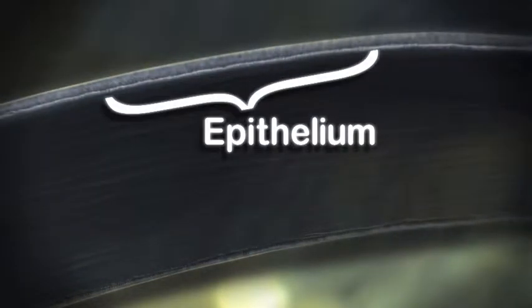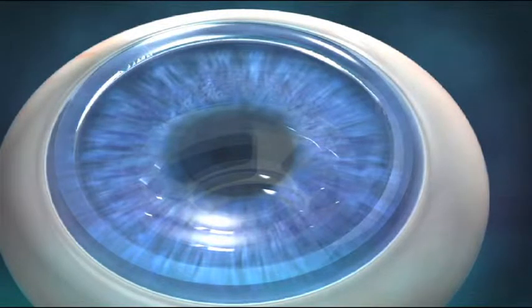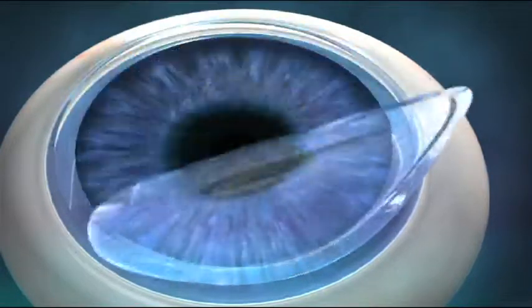The front layer of your cornea is a protective skin cell layer known as epithelium. The great thing about epithelium is that that is a regenerative layer. That's not so good for trying to permanently correct your vision though. If we were to reshape your cornea starting with the first layer, in just a few days we'd be right back where we started. So instead, what we do is make a flap, so that we can get past the first layer to the next layer.